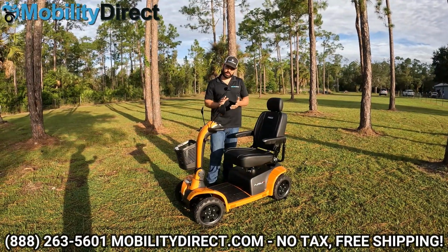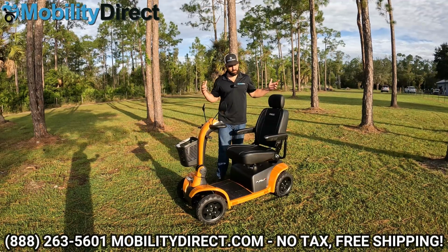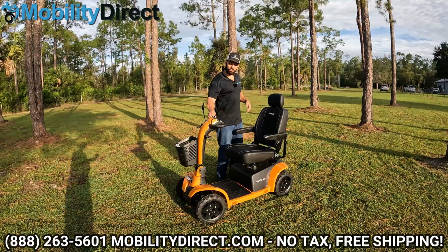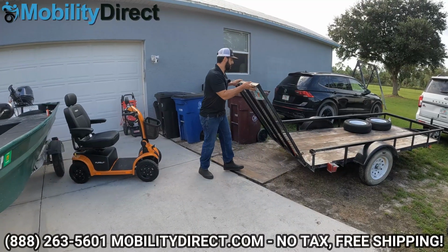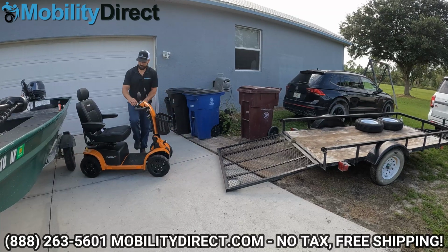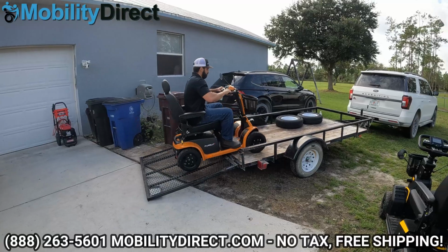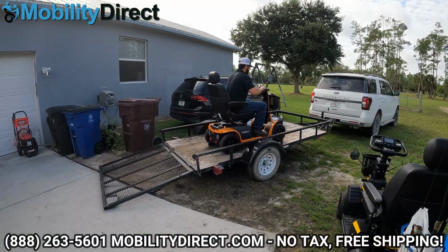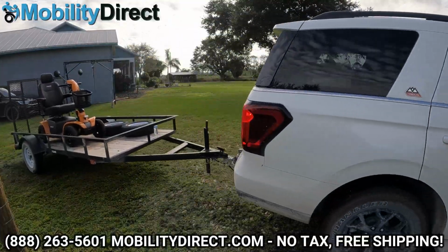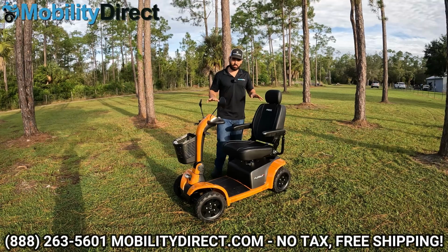Now, a common question that a lot of people have is, how do you transport this thing? Well, it is heavy. It's just under 250 pounds, so there's really not going to be an easy way to do it. However, we have used a utility trailer, which is kind of like used for putting lawnmowers or ATVs, has a little ramp that folds down in the back, ride it right up the trailer. That's going to be the most affordable way. And you can use the trailer for other things like moving furniture, moving lots of things, not just scooters. Hands down the most affordable way.